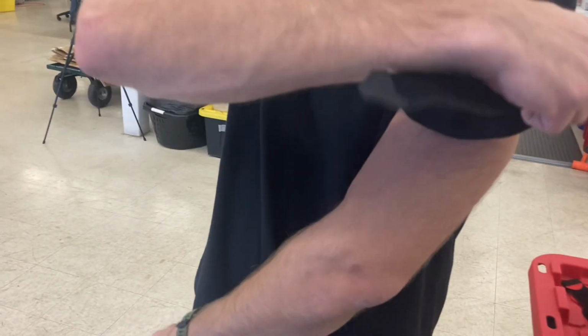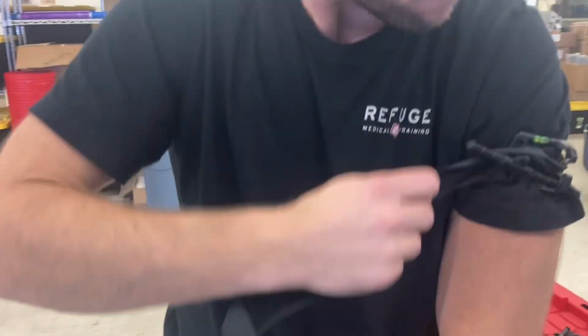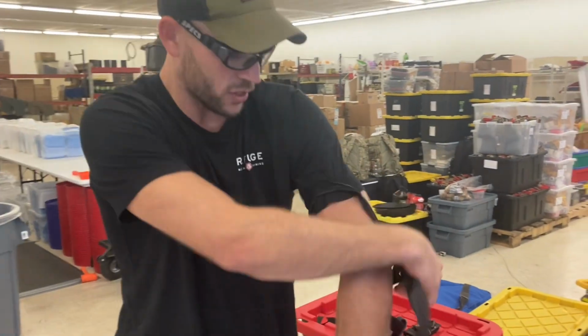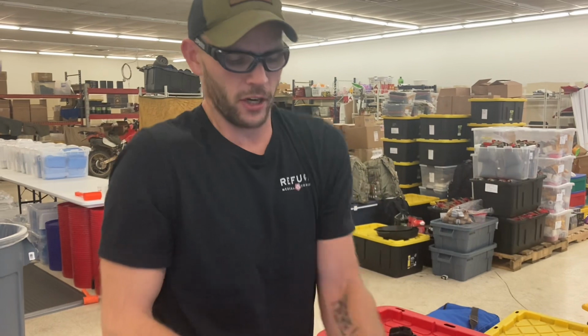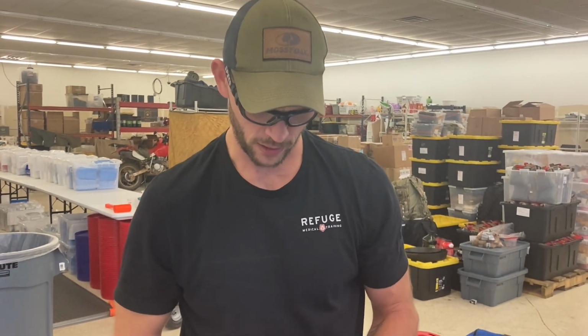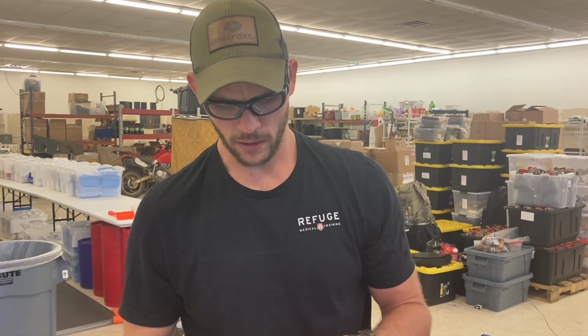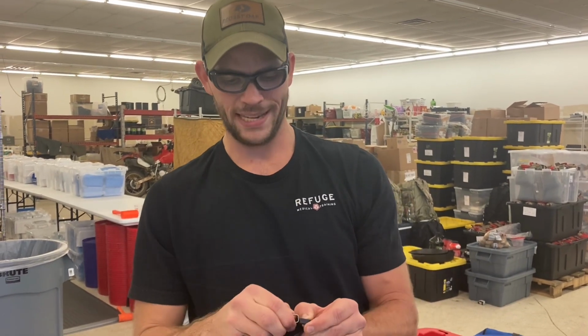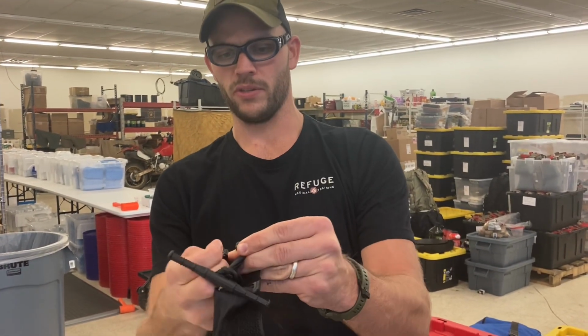You can see the vascularity in your biceps, the difference there. Yep. But it's too specific. I shouldn't have to care about why it's twisting up. I shouldn't have to care about what direction I twist the windlass. The locking mechanism is, to me, somewhat overcomplicated but weaker, which doesn't make a lot of sense because I can just so easily flex this to where this system is now not working at all. And that's what happened on the leg.